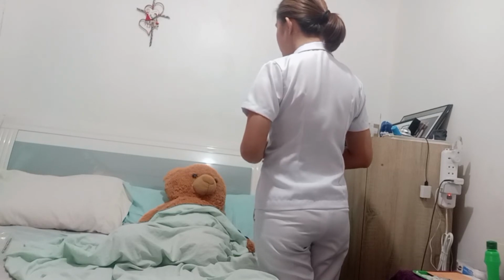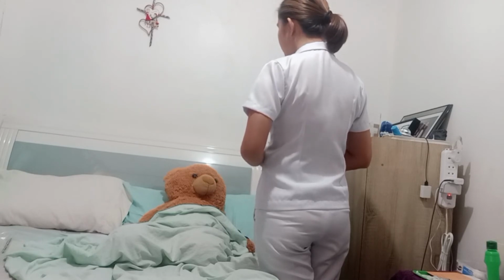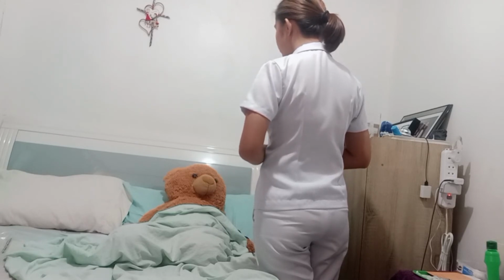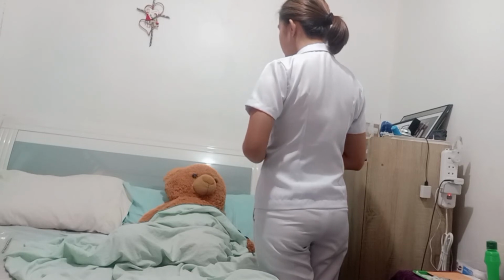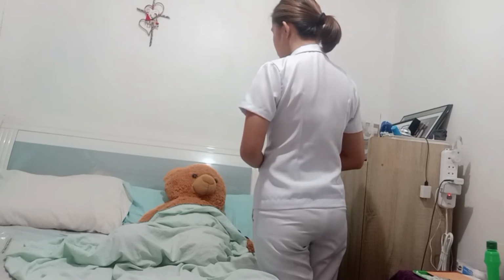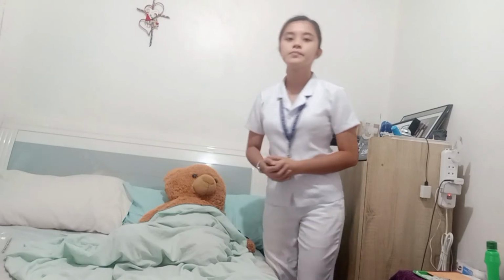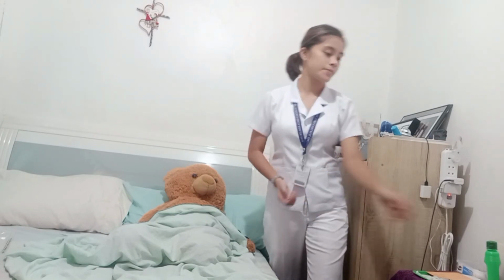When you get tetanus vaccines as recommended, your body makes antibodies that will help your immune system fight the toxin produced by the bacteria. So, ma'am, a few minutes after injecting the vaccine, you will feel numbness or pain at the injection site, which is actually normal. Will that be alright with you, ma'am? Now perform hand hygiene and observe appropriate infection prevention procedures.